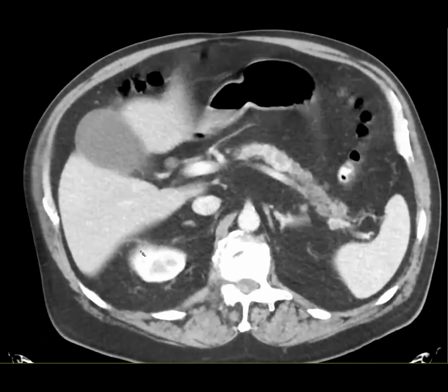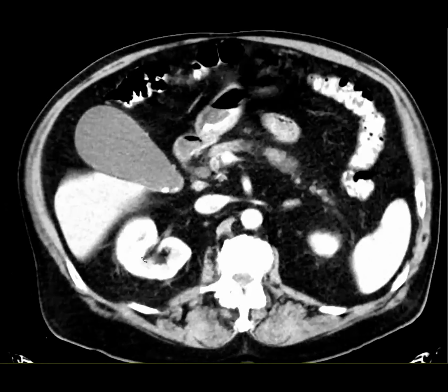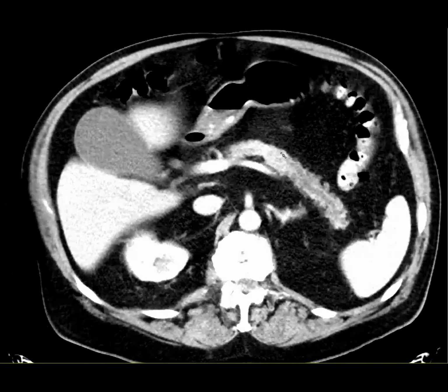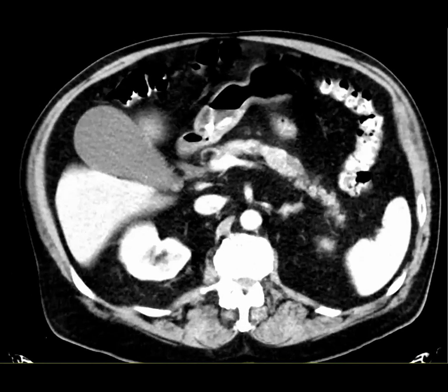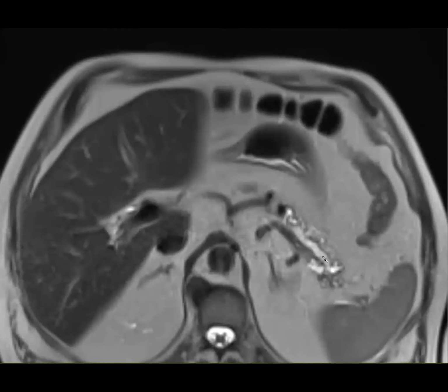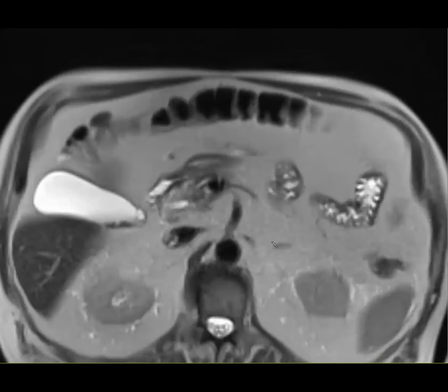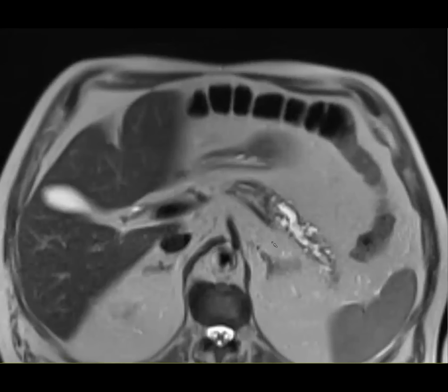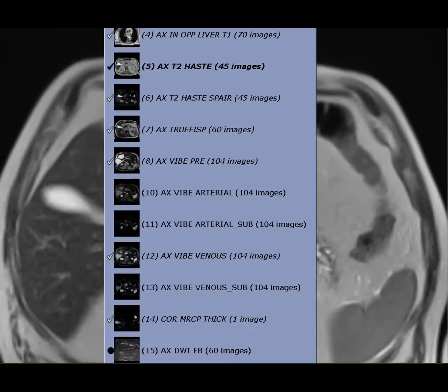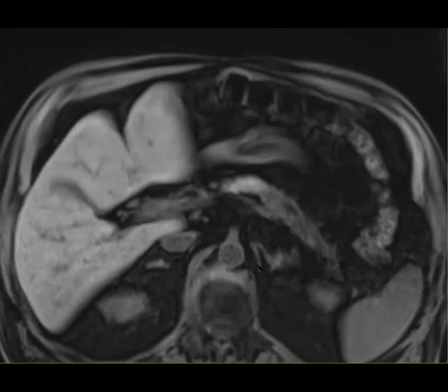And then they also made a really nice call in the pancreas. Ductal dilatation, maybe a ductal cutoff sign in the body. Yeah, exactly. And they did get an MRI, and I'll show you the MRI. So we've got ductal dilation with some side branches, and then you said a ductal cutoff sign, good. So what are you concerned about? I don't see a discrete mass there. I mean, always concerned about underlying mass, but it could also be a main duct IPMN.